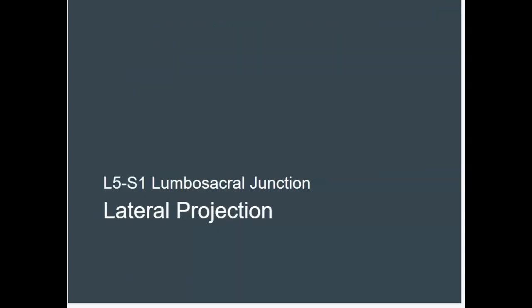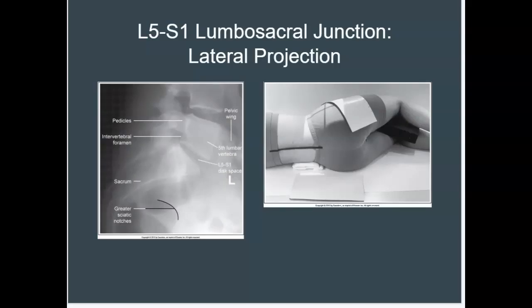Let's move on to the L5-S1 spot projection. Image analysis guidelines state that the intervertebral foramina between the L5-S1 junction should be demonstrated open. The right and left pedicles are superimposed and in profile. The L5 vertebral body and sacrum are demonstrated without distortion. Pelvic wings are nearly superimposed. The L5-S1 lumbosacral disc space should be at the center of the exposure field, and the fifth lumbar vertebra and upper sacrum should be visualized.